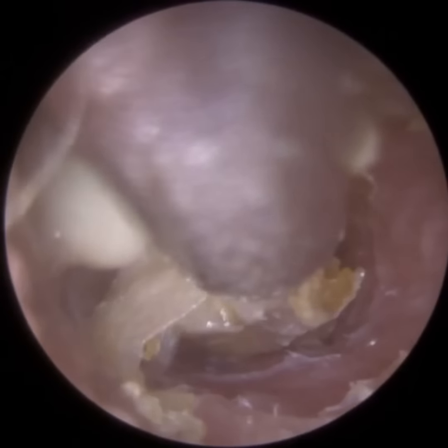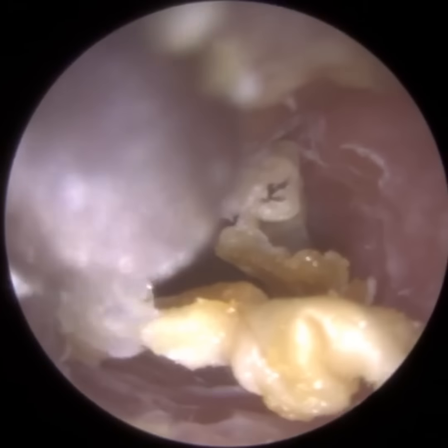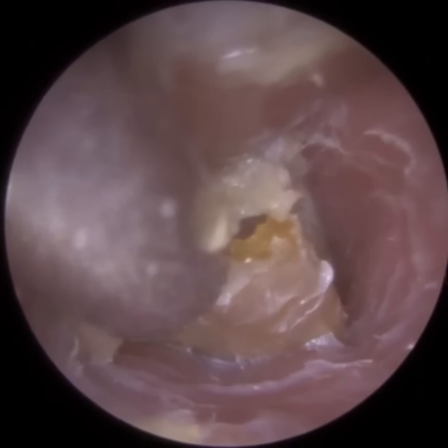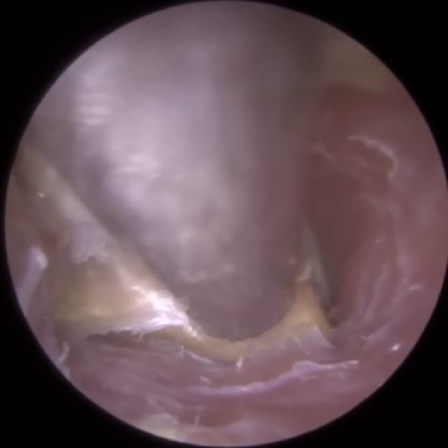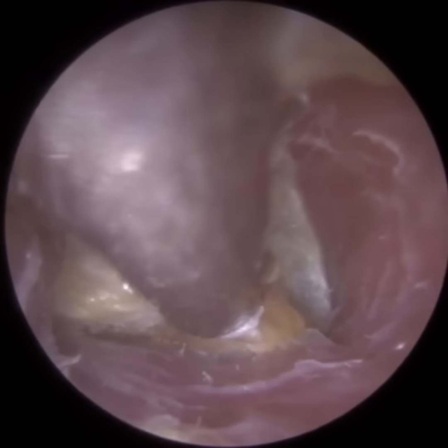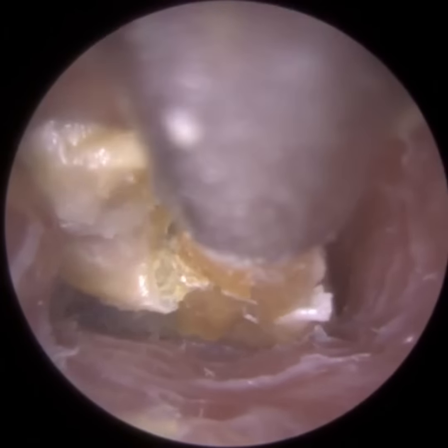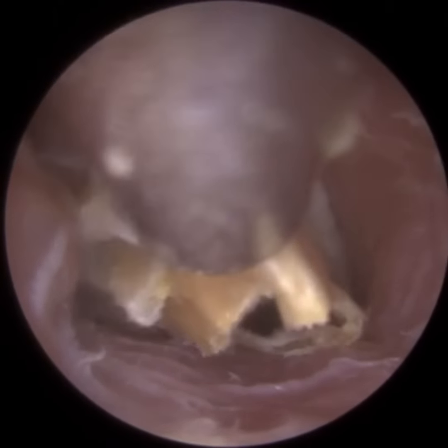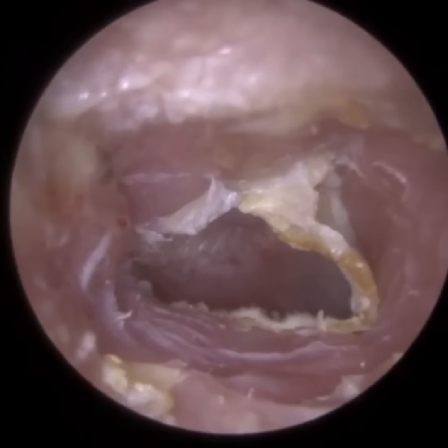So I've just gone to the top. I'm going to come down on it. You can see some of that infection, some pus there, some granulation tissue underneath. And you'll have a better perspective in a minute of the swelling. You can see the swelling on the left-hand side on the top of the ear canal, which has engulfed this plug. And the skin is like double-sided sticky tape. It's really strongly adhered to the canal wall.